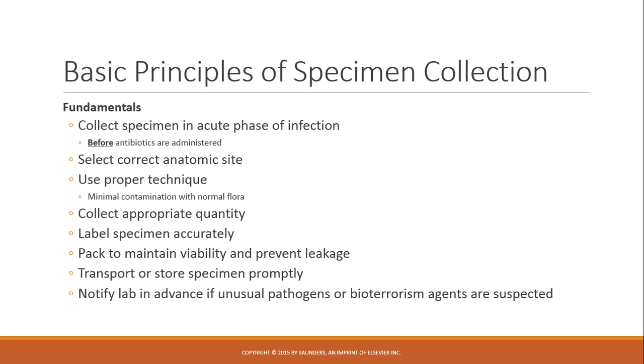They're still able to grow by the time it gets to the microbiology department. Physicians' offices may collect samples early in the morning, but the courier may not pick them up and deliver them to the micro lab until late in the day. So it's important that the proper transport media is used for transport containers, and that all depends on the type of sample that you're collecting. Transport and store specimen promptly. The sample may require refrigeration to preserve it. You certainly want to avoid any high heat temperatures.